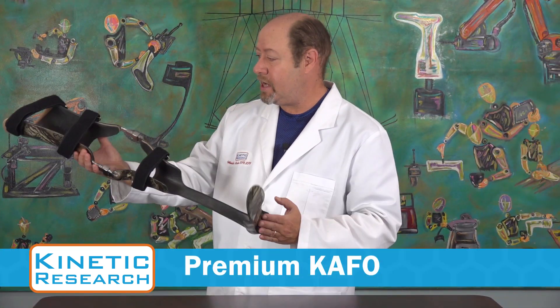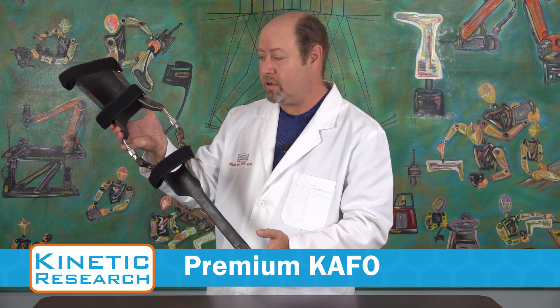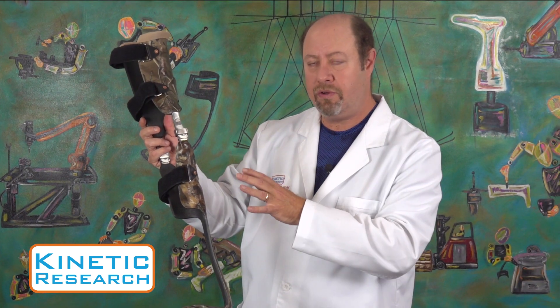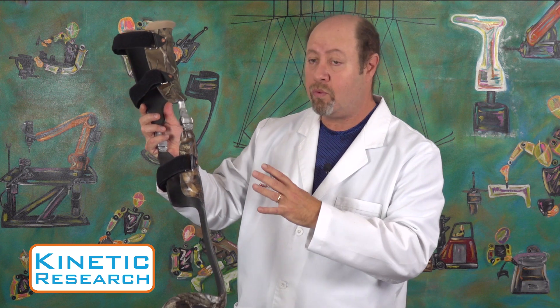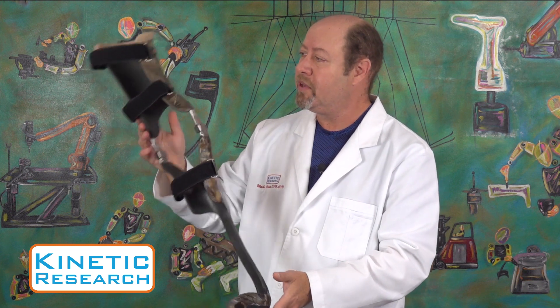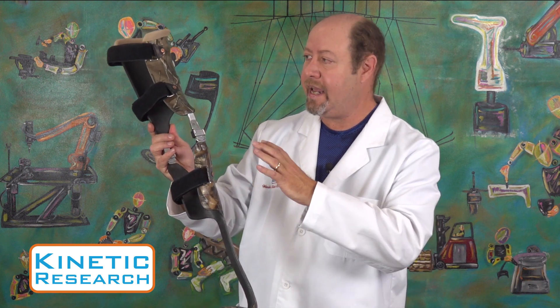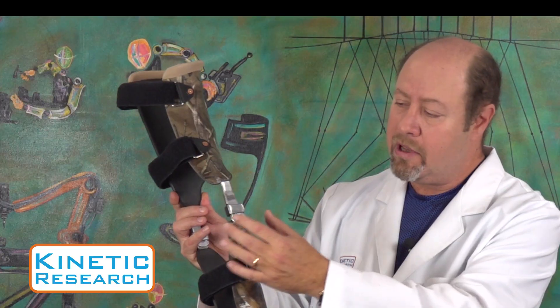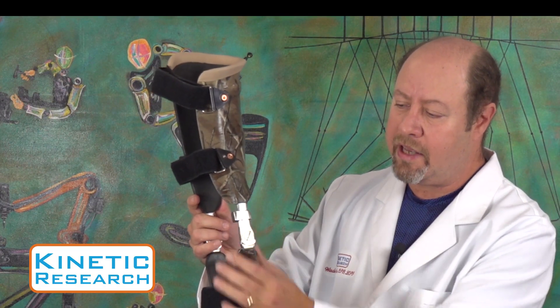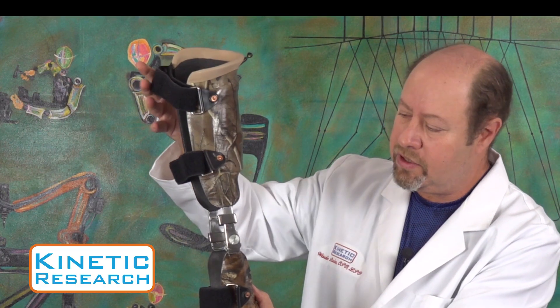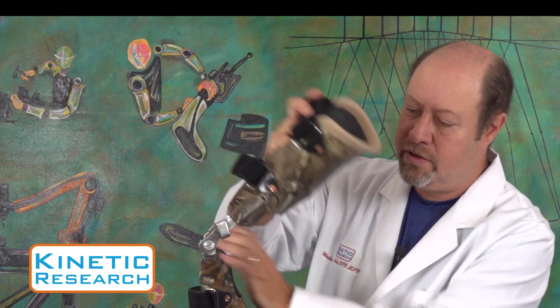This is an example of our premium KAFO. It's built much heavier duty. Even though it's lightweight relative to what it's doing, it's a significantly heavier layup because we have a locking mechanism that we've integrated into the knee component.